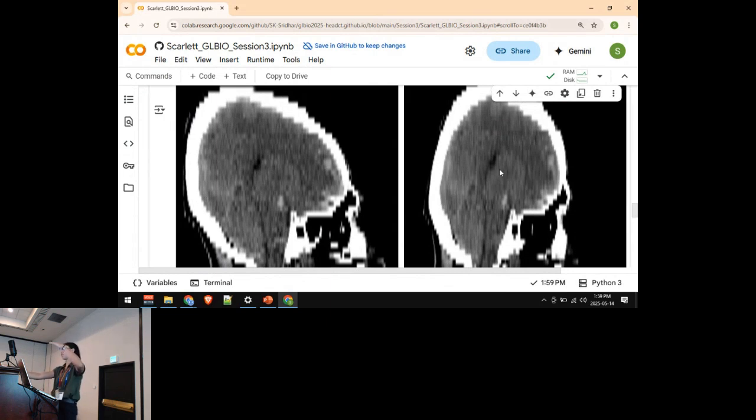Most of the time, patients go into a CT scan, they don't go in flat. They go in at an angle just so the radiation doesn't hit the eyes and so on. So the bed is a little bit tilted, and the tilt angle is actually written in the DICOM metadata. So the DICOM to NIfTI converter actually uses that metadata to tilt correct it.